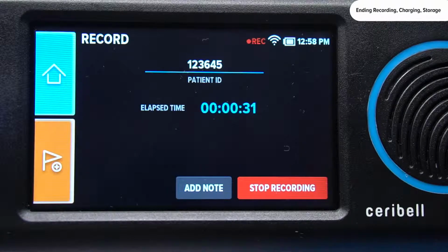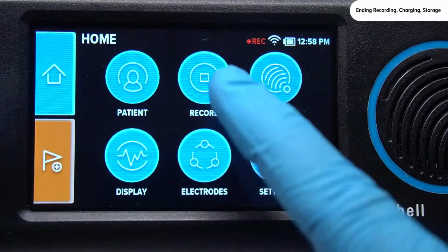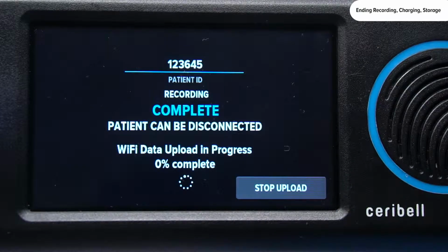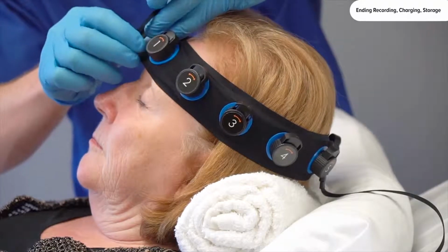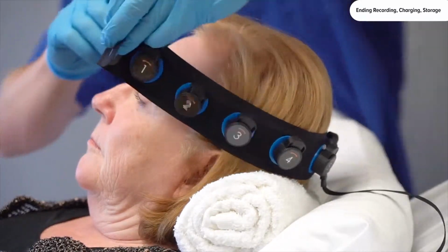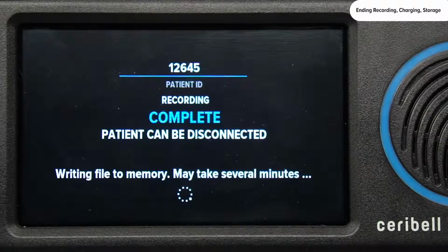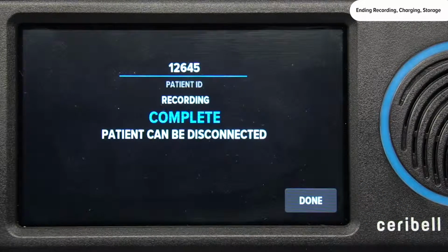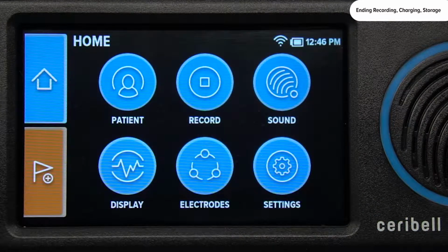To stop a recording, go to the home screen and touch the Record button. Then touch the Stop Recording button. You can now disconnect the headband from the recorder. Remove the headband and clean the patient's head. Wait for the Wi-Fi upload to complete, and a message will be displayed confirming that the recording was successfully uploaded to the Ceribell EEG portal.